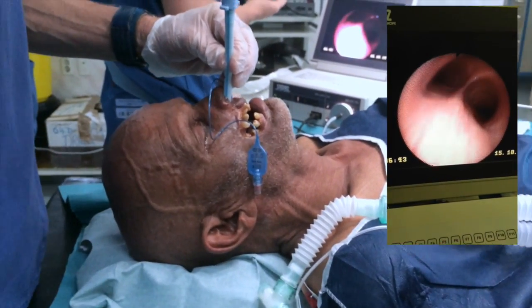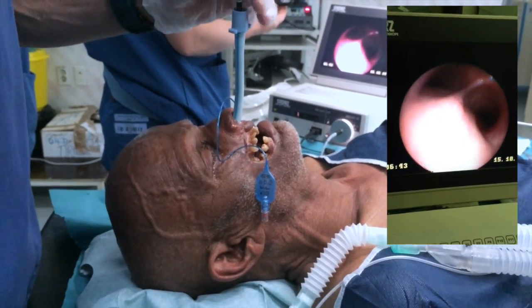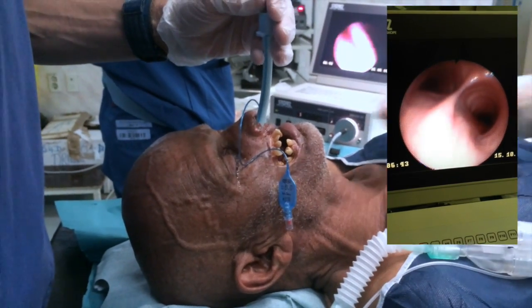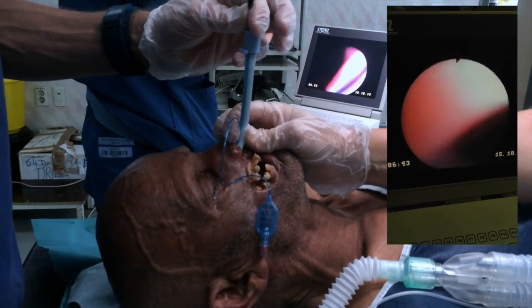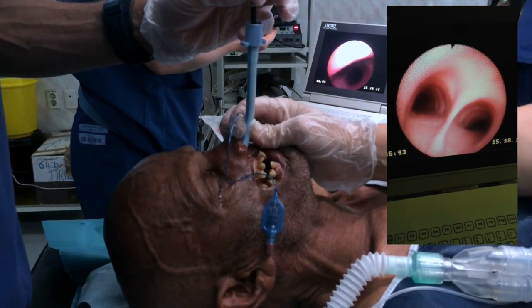So you have tricks for the... Okay, so the bevel points posteriorly and that avoids catching on the arytenoid cartilages posteriorly. So that's the tube gone in as far as I want it. I'm going to advance the scope down to the carina. Okay, Gru, can you hold the tube for me? I'm holding. Okay, at this point now I'm going to withdraw the fibroscope with the lever neutral so you don't damage any of the fibers.